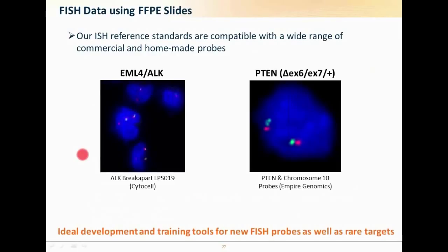And we started to test a number of different probes from different manufacturers, and it's highlighted for us, and I haven't been able to show all the data, that using different probes, you certainly need to use different methods and different protocols. Because if you have one standard protocol and you use, say, a probe from Empire Genomics, a probe from Cytocell, a probe from Abbott, a probe from Createch, the performance of those probes will vary greatly.